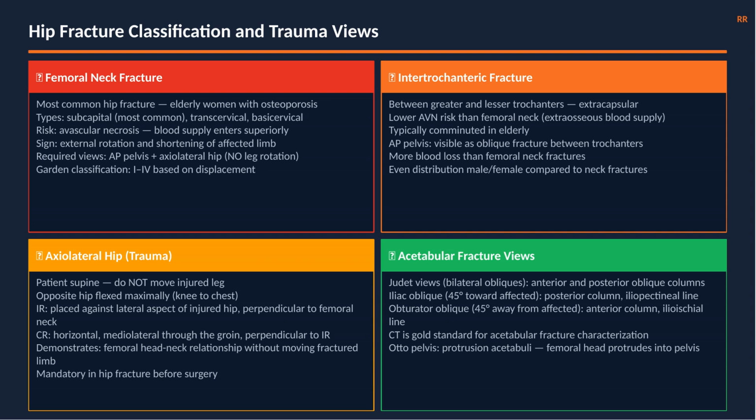Axiolateral trauma protocol. Patient supine, do not move the injured leg.